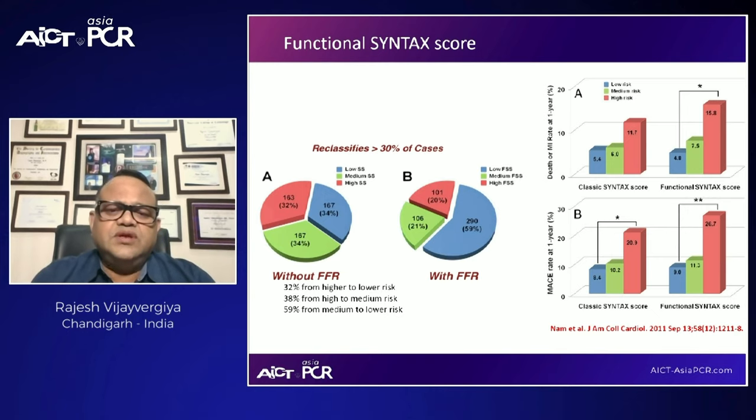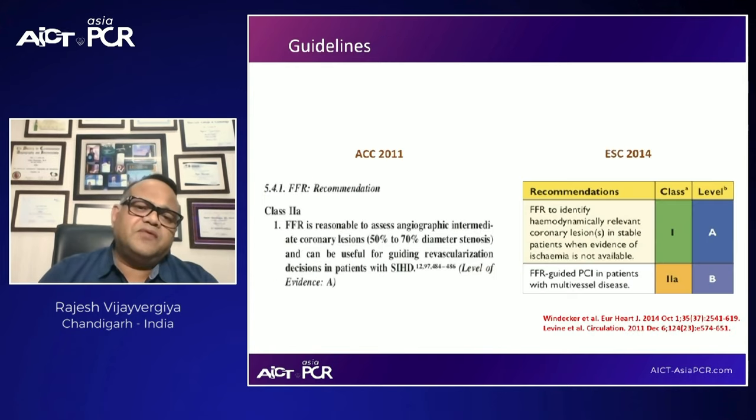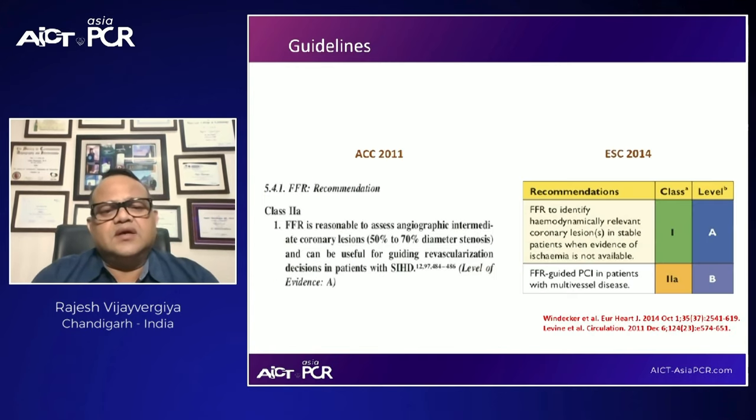And this also leads to a change in the management part. There is a significant change in the patient cohort, which is to be subjected to, say, medical treatment, PCI or CABG, and it also results in a different MACE rate at 1 year of follow-up. So FFR does help in improving the clinical outcome in patients who have been subjected to functional assessment followed by coronary intervention.